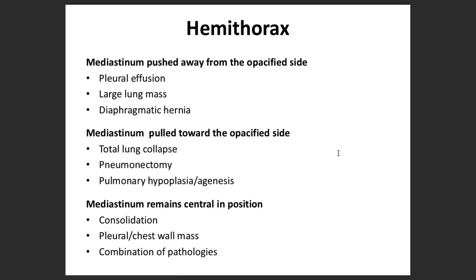So now you are able to understand not just how to differentiate ARDS, but also the different causes, right? For example, whether it has been caused by a lung problem or by something else.